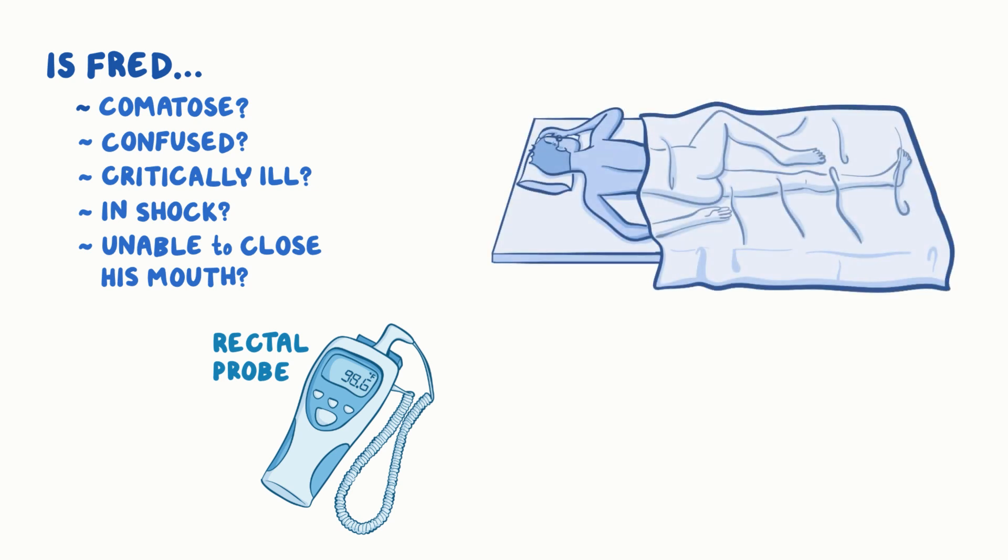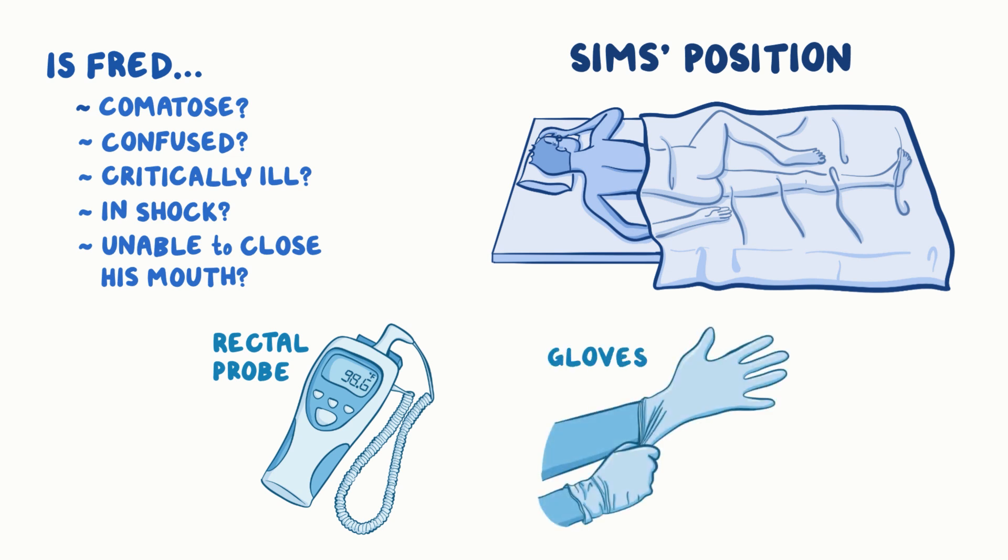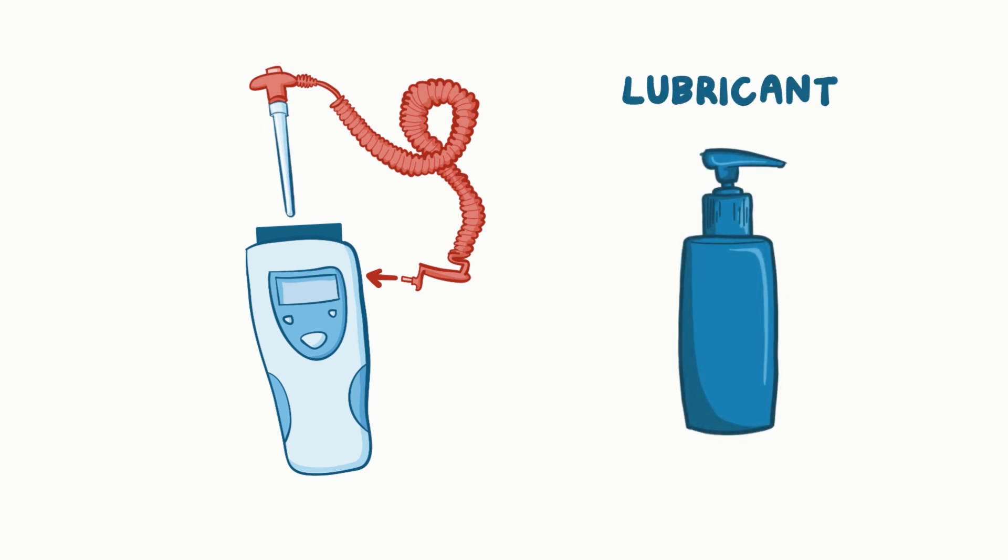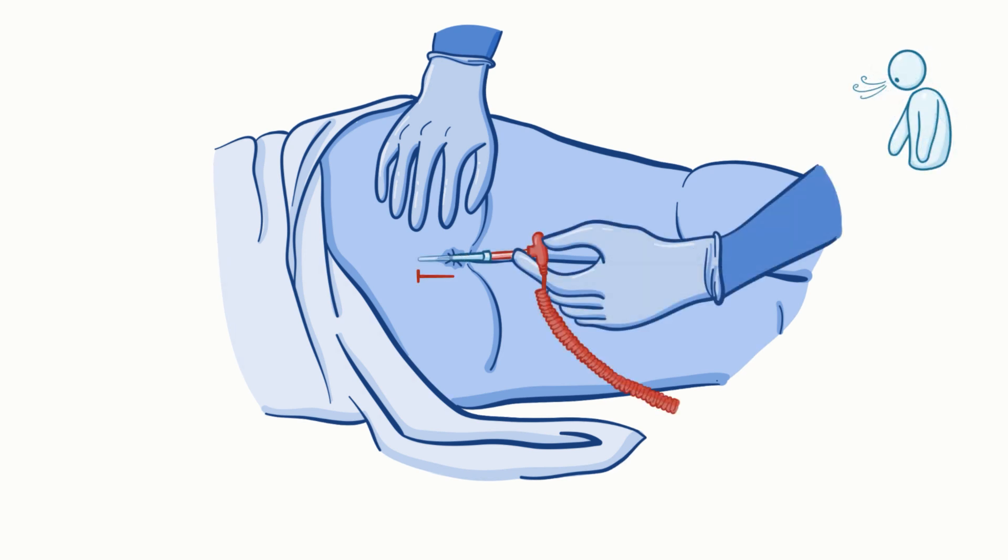Roll Fred over and into the sims position with the upper leg bent. Wear gloves. Attach the red rectal probe stem to the thermometer. Slide over a disposable probe stem cover and apply plenty of lubricant. With one hand, separate Fred's buttocks. Ask Fred to breathe slowly. Now insert the lubricated probe about three centimeters just over an inch deep into the direction of the umbilicus.